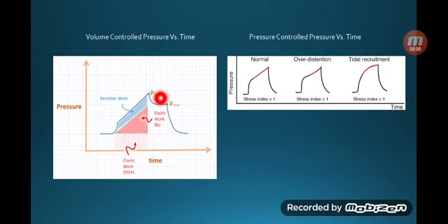Part of it is the tube itself. If it's narrow, if it needs suction, if it needs clearance, then that would tell you something about it. And if your PEEP is not enough to get the lung in a better status to make it easy for the next breath, then you might need to get the PEEP a bit up to try to nullify that amount of resistance.